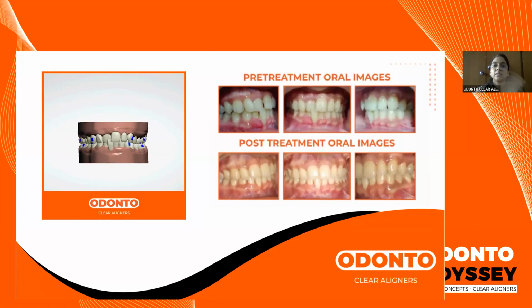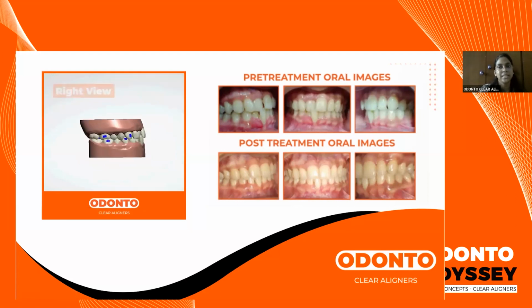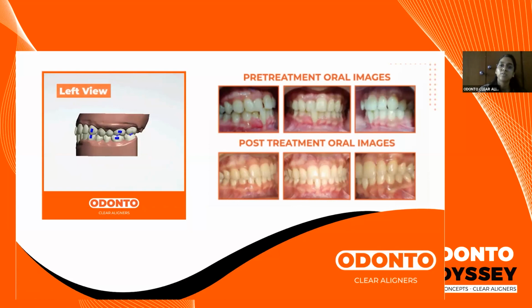But if you have something simple, as in this scenario which we have right now, wherein you just have a single tooth crossbite, the posterior occlusion is quite stable. We need to relieve this anterior crowding, as well as the upper arch crowding. So let's have a look at how it progresses. We bring about a certain amount of expansion, a little proximal reduction will have to be done in the anterior segment, and then we push the teeth into the arch shape. So this again falls into your mild category.